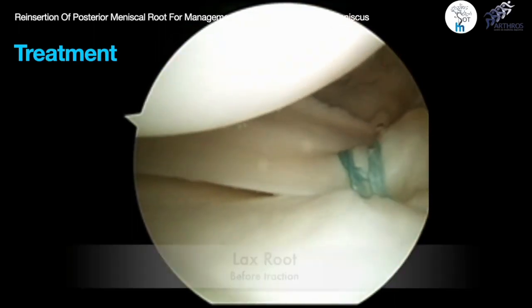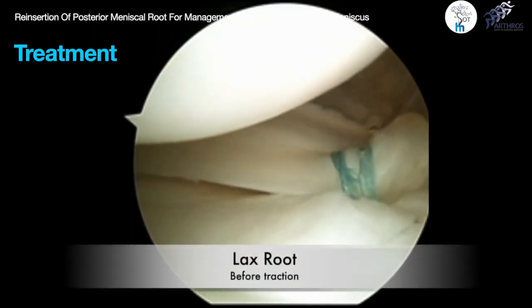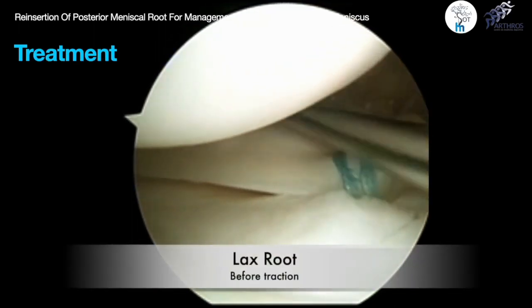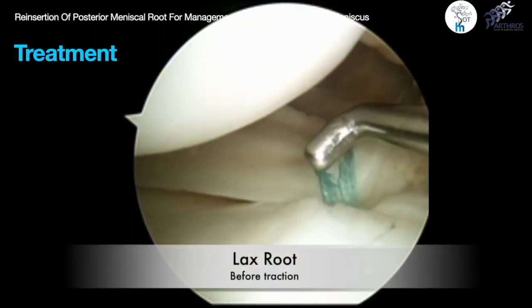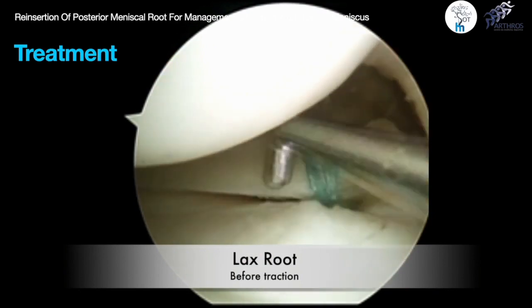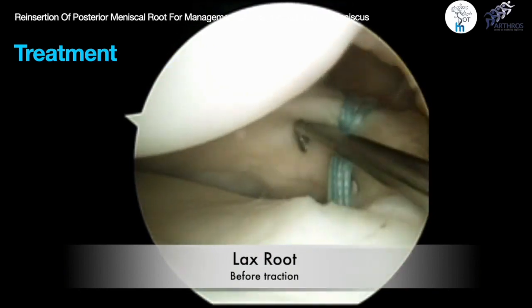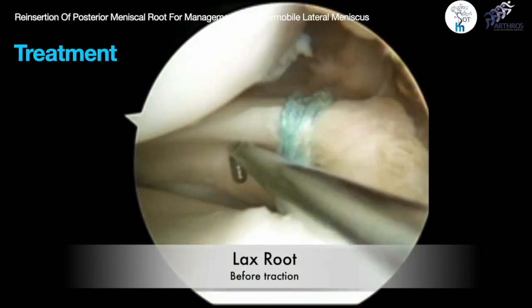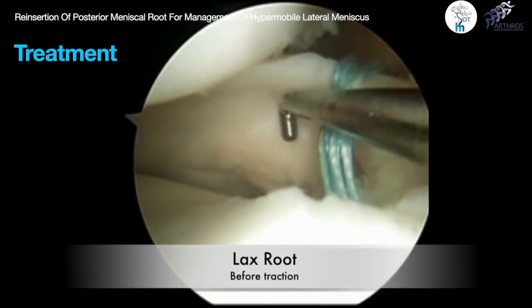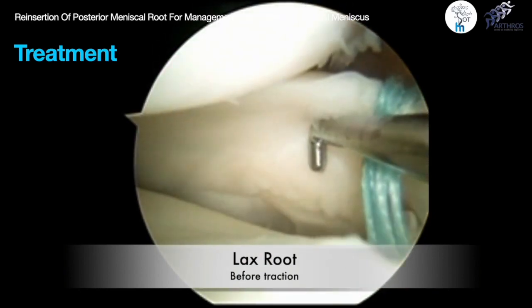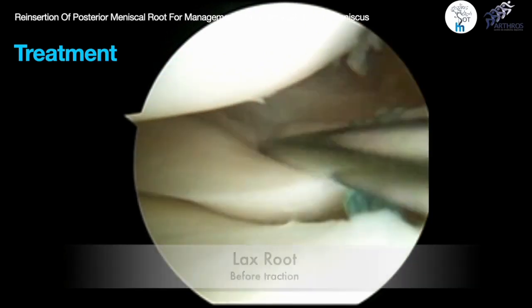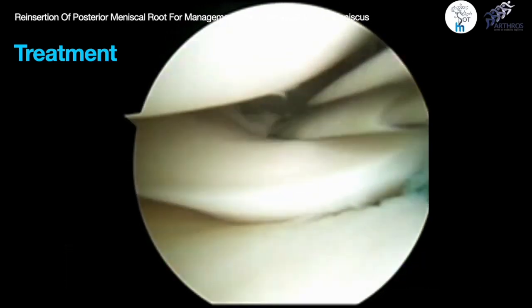Before final fixation, we confirm meniscal stability by pulling on the sutures and ensuring that the aspiration test, posterior horn traction, and posterior root laxity were all negative.